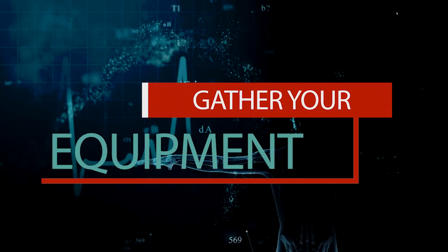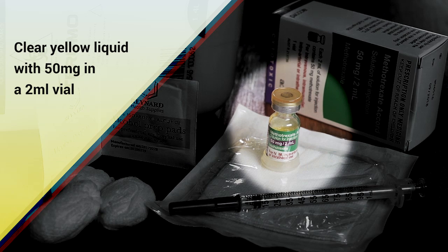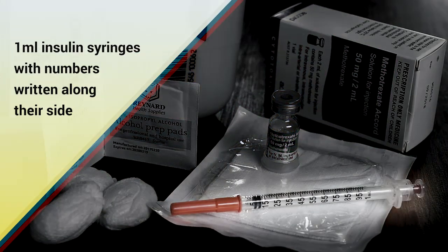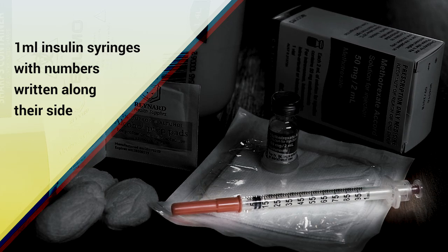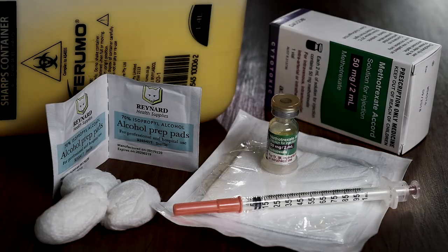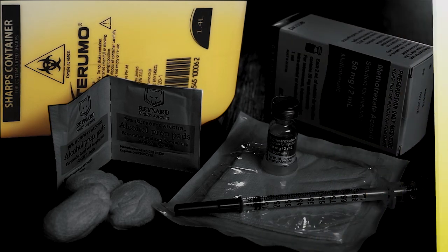Step 1: Collect your equipment. The injectable methotrexate is a clear yellow liquid with 50 milligrams in a 2ml vial, and there are usually 5 vials provided on each prescription. A 1ml insulin syringe has a really fine needle and numbers written along the side to help you draw up the correct amount of methotrexate for your dose. You can purchase these in packs of 10 from your local pharmacy. A sharps container for disposing of the syringe after the injection can also be obtained from your local pharmacy.